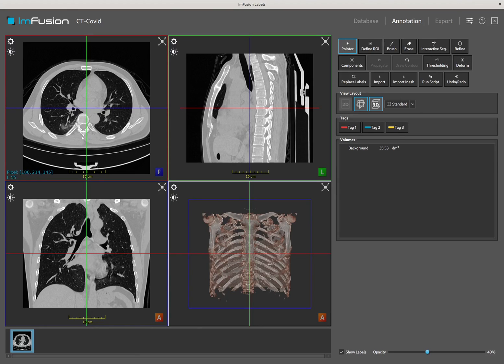For this demo, we will try to segment the healthy lung tissue, ground glass opacities, and consolidation.